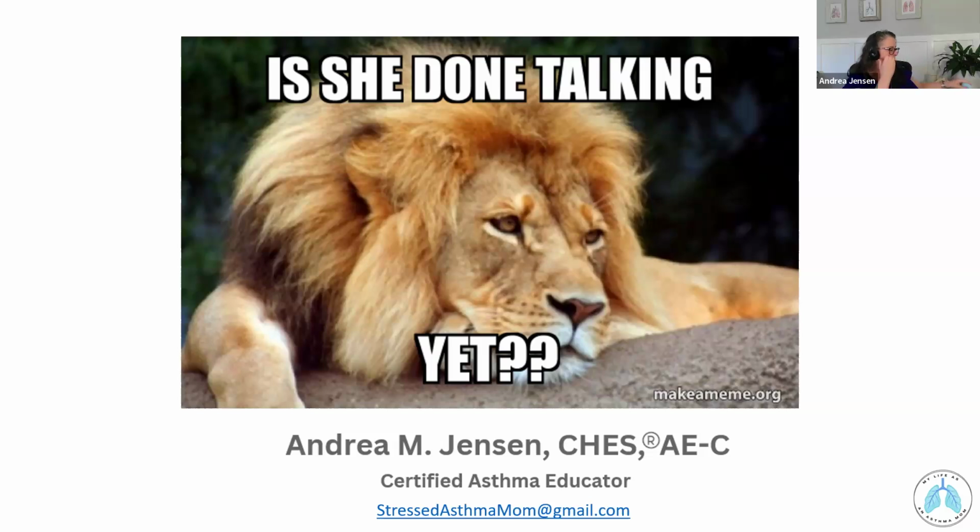And then, the other thing I was going to say about when you are helping people with their inhaler technique, if they're struggling, I always would tell them, you are in good company. Over the years that I ran the asthma home visit program, I had one participant that had correct inhaler technique. Nobody else did. A lot of people were really close. And really, I put that graphic in there this morning because it's not going to help you at all to shame someone or make them feel bad. So just gently correct them and then step back with them. Check back if you have a visit 2 weeks later or however much later it is if you're doing asthma home visits, and say, how's that working? Do you feel like you're getting more medicine? They're like, yeah. I had no idea that changing a couple little things could really help. So those CDC videos are great.